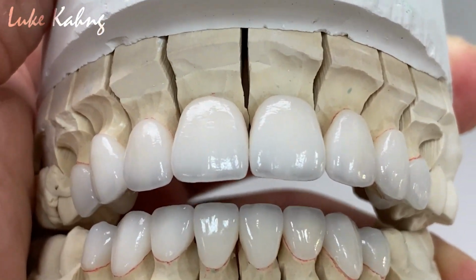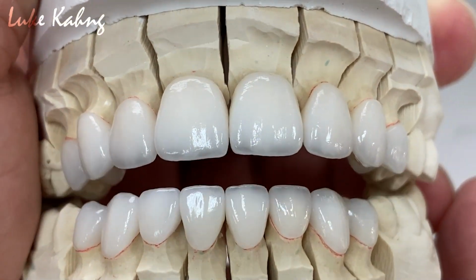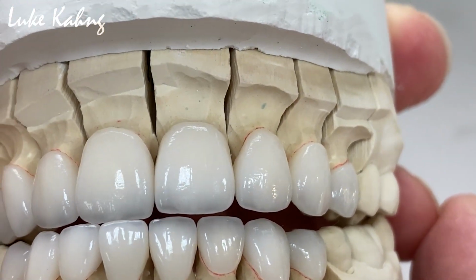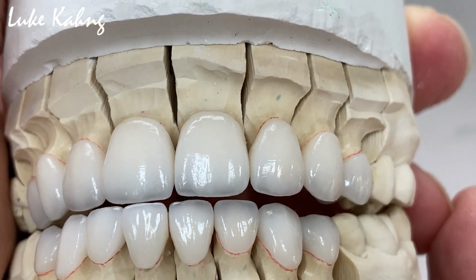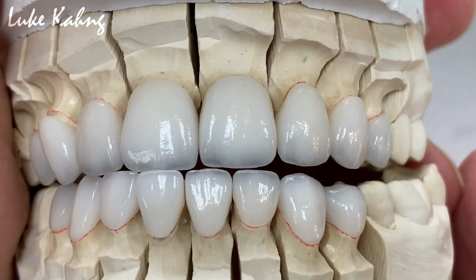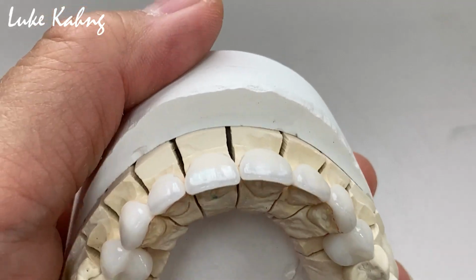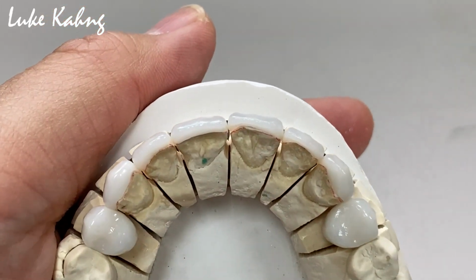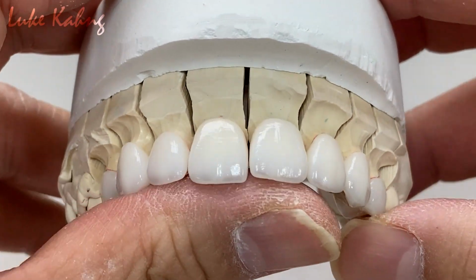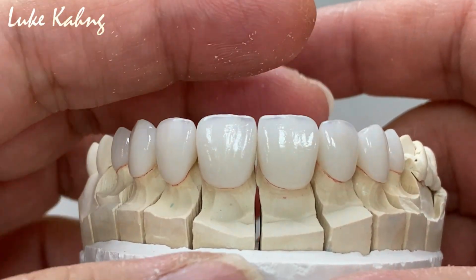Alright, this is the 16 unit cosmetic makeover case from the wax up design, and they make a good amount of natural transparency from the incisor third, and then finalize the restoration. So basically we make good golden proportions of the tooth. It's individual veneers and crowns, and they make this good contour and shaping from the treatment plan wax up.